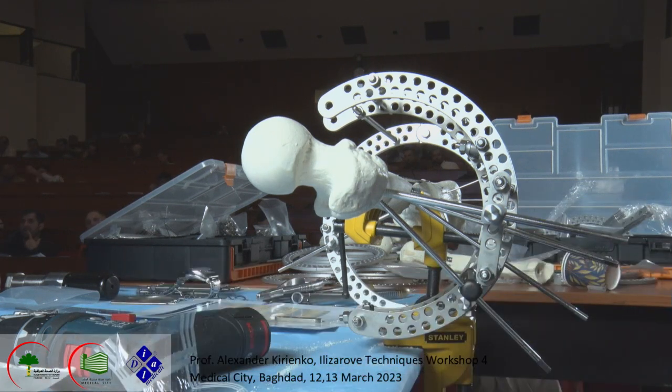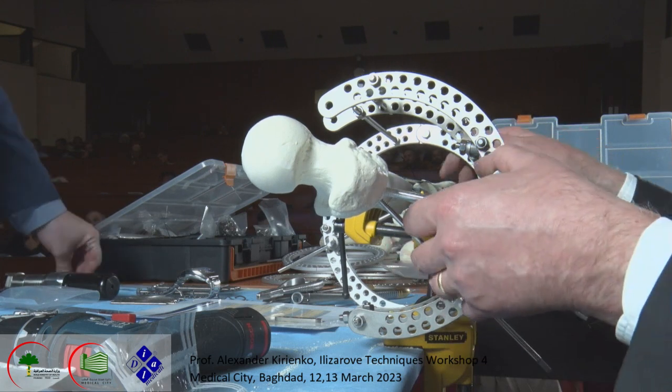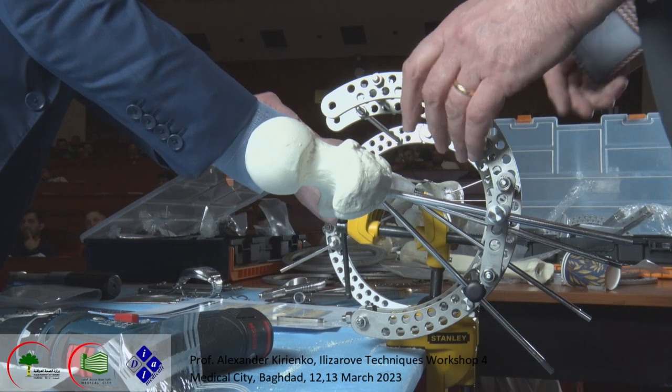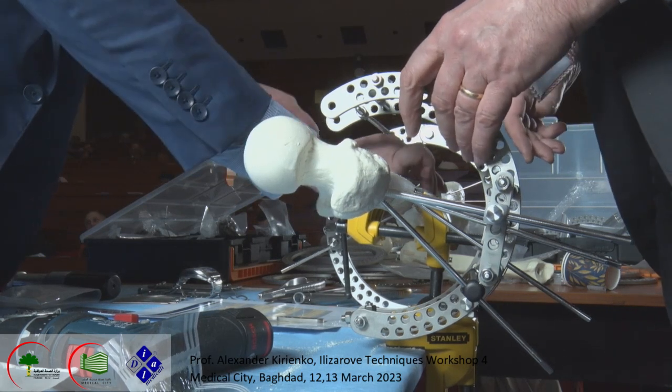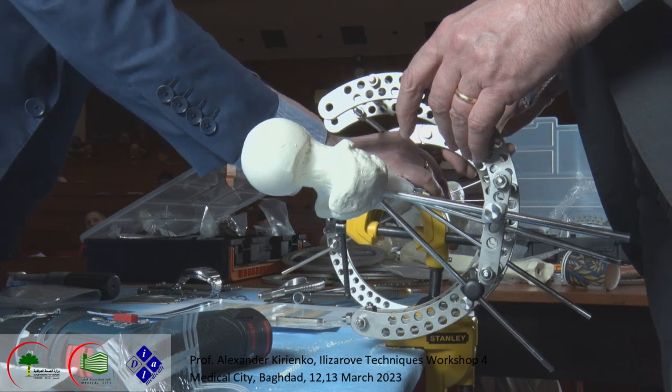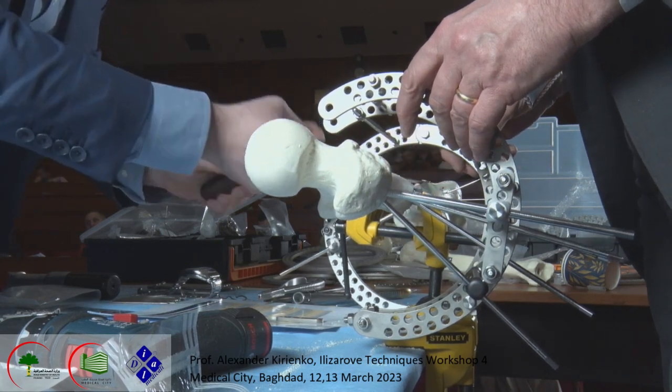What we do now, we remove the plate, yes, and we will be in real life with a defect of the femur.